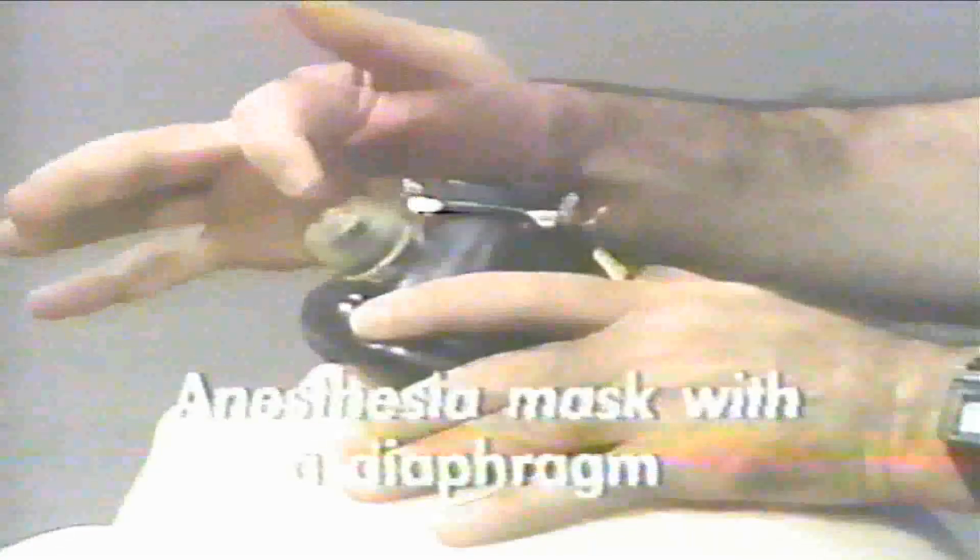Aids to fiber optic intubation. There is a special mask for this purpose. This mask has a hole with a plastic rubber covering, and this would allow the passage of the fiber optic and the passage of the endotracheal tube through it. Mask anesthesia is started and is continued up to deep levels of anesthesia. Then fiber optic intubation can be performed while the patient is fully anesthetized.